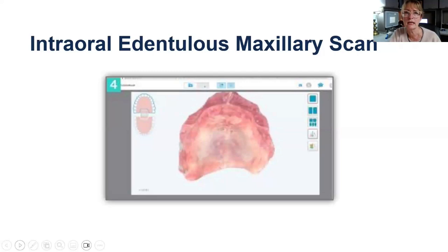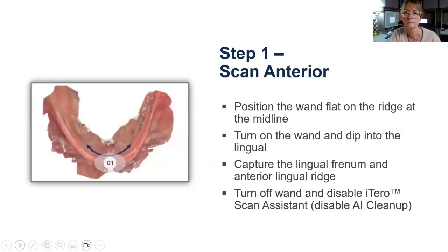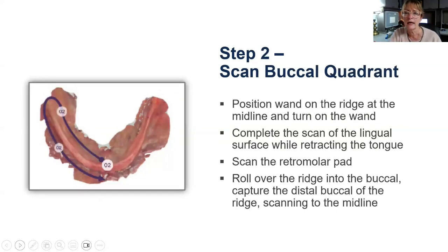That's an intraoral scan. And then we'll do a little bit of the lower. So in the lower, we're going to start at the midline and start at the frenum. And we're going to do one side and then the other.